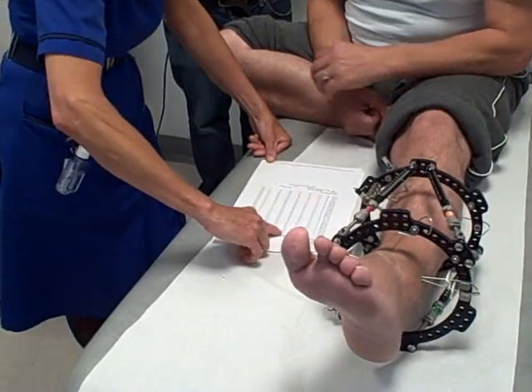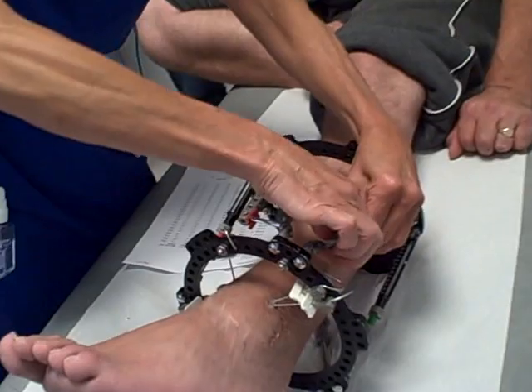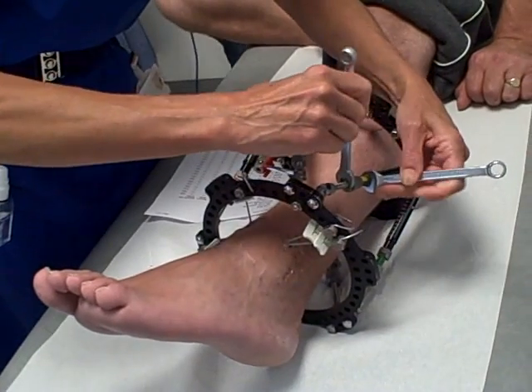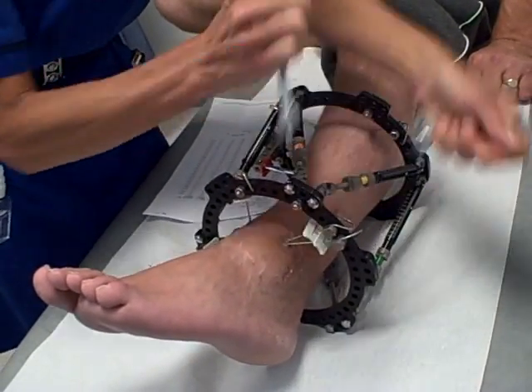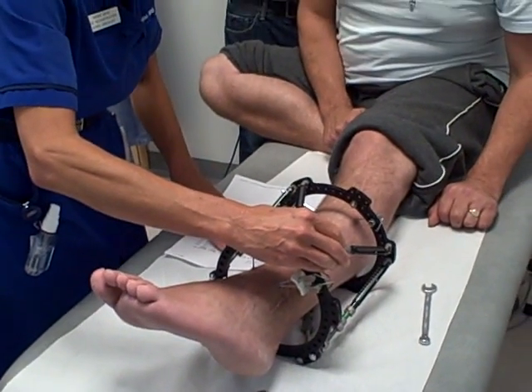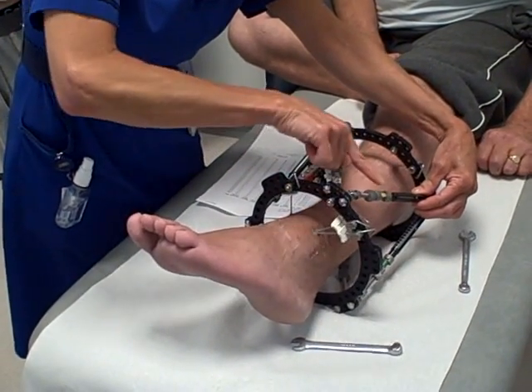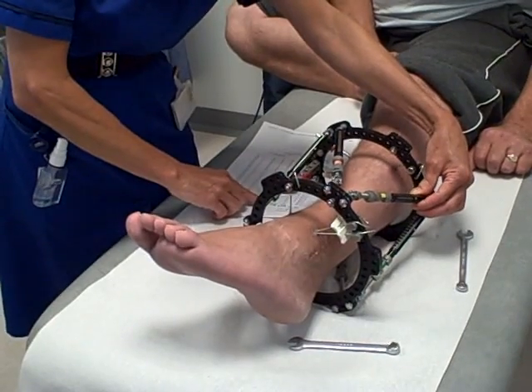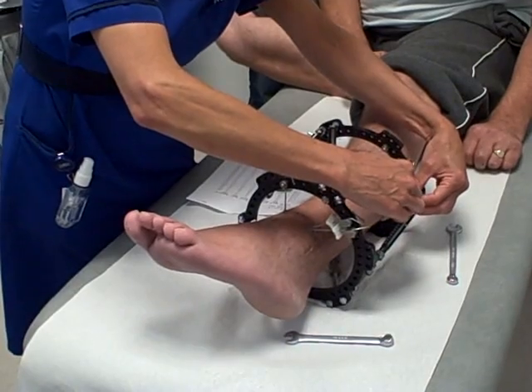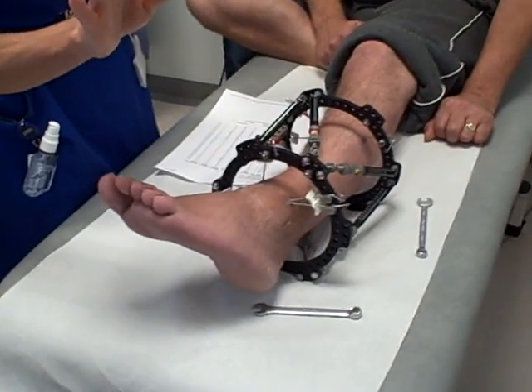Number three is going to change from 175 to 176. So what you're going to do is take off the lock — we've made sure these are all nice and tight when you came back from theatre. I'll use the spanners to loosen them. That's the lock off. Now we're going to move it from 175 to 176 — turning the way the arrow goes. You can see the arrow is pointing towards plus, that's where we're adding. So we go up one, and as we move it we move up a little. I'll show you on a separate strut just to make sure.